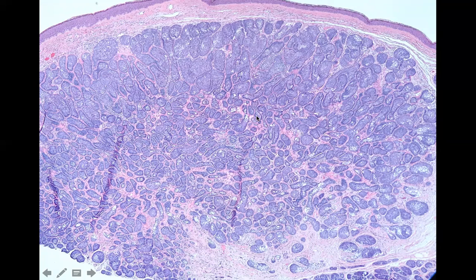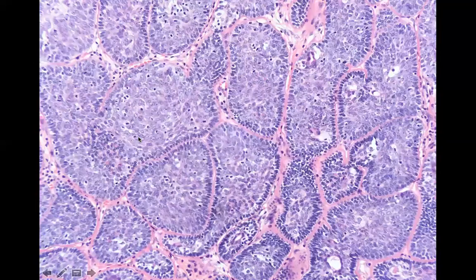You're like, oh, well, how do I know that's not follicular? It even has a little bit of the separating stroma, which doesn't help. But when you go in close, you get a lot of this very, very pink hyalinized stuff. And if you look even closer, you might see little holes, right? These little holes are ductal structures. So this is a cylindroma, and it is a ductal lesion. See the little holes?